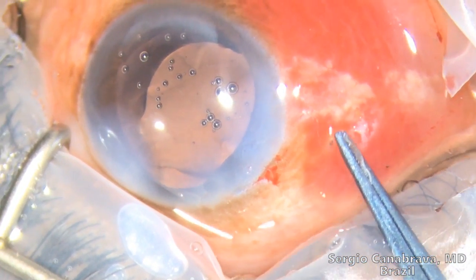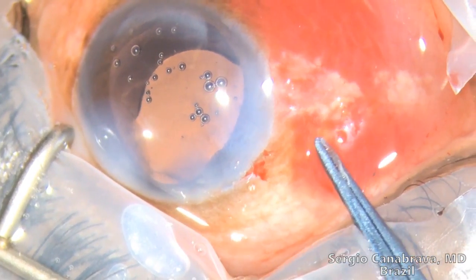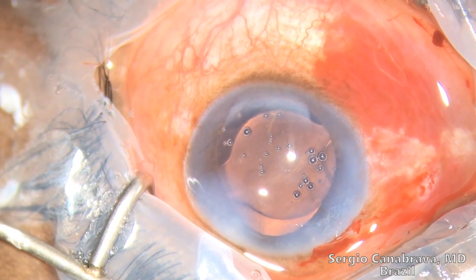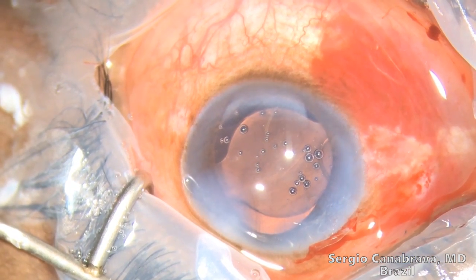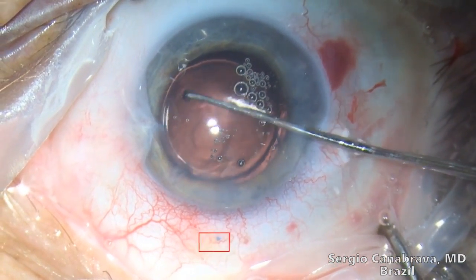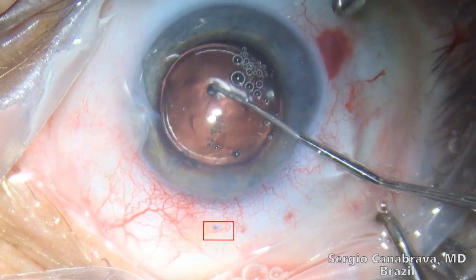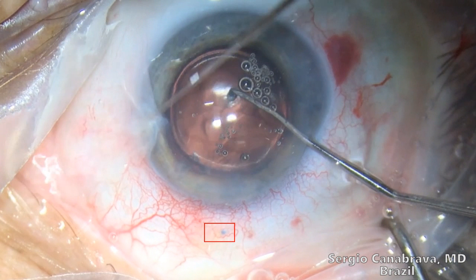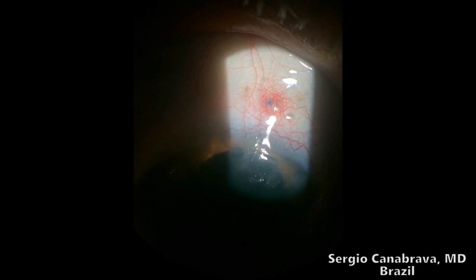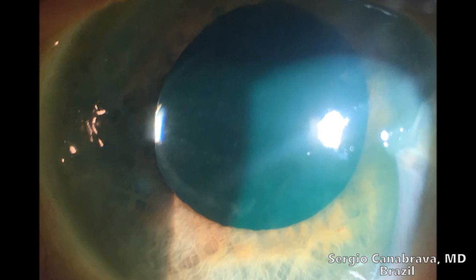You can see how the flange is inserted into the sclera using a McPherson forceps. The final result — in another patient, you can see how the IOL is stable inside the eye. Pay attention to the flange in the red square. This video shows post-operative results. You can see the flange and the IOL is stable.